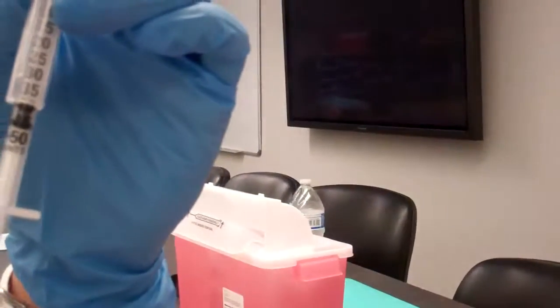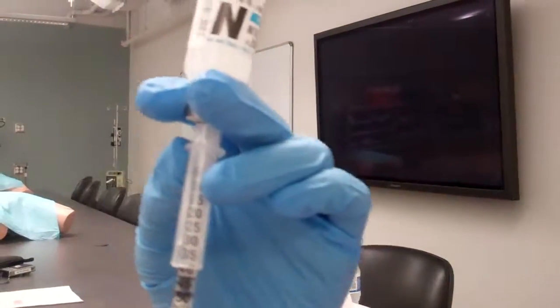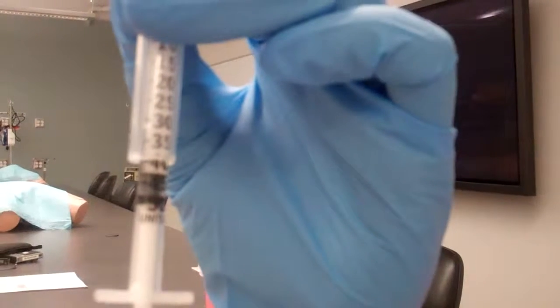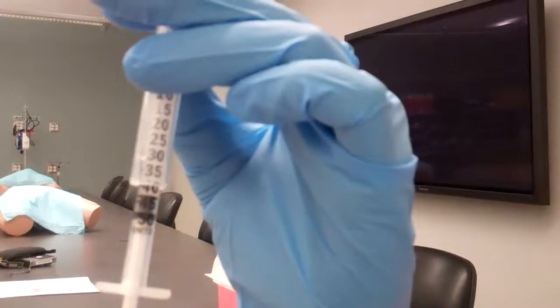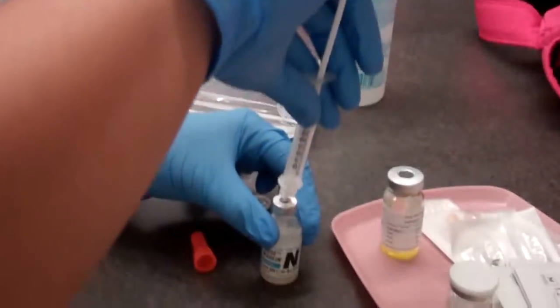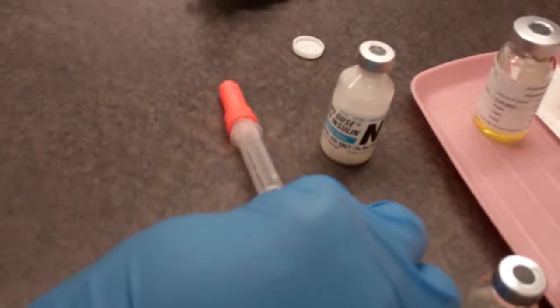One, 2, 3. So I'm going to have another nurse verify what this medication is. That's 43. And the medication? It's cloudy. It's the NPH. Alright, thank you. Okay. So I'm going to withdraw that, scoop it in, and then cap.